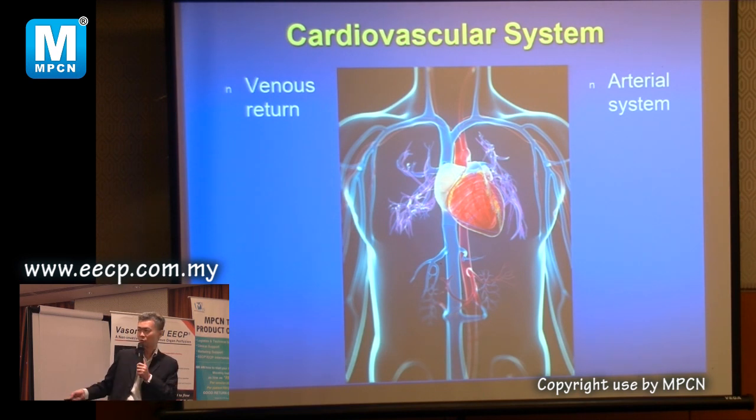But there's a group of patients where, when you squeeze this, it can cause danger. So for doctors, what are the contraindications, where you cannot squeeze so much blood into the heart? What are the conditions? Pulmonary hypertension, yes, one. Not AF. Heart failure. If you have a lot of water in your lungs already, and you squeeze more blood into the right heart that goes to the lungs, you put them into pulmonary edema. So if your patient has heart failure, cannot do EECP. Can, but you have to make sure they are dry.